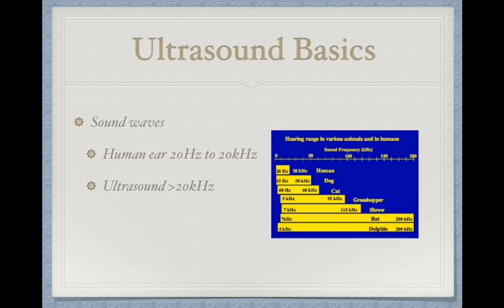And as you can see on the screen here, that's along the lines of what bats and dolphins can hear. So this is really high frequency sound, and not typically what we would hear on that spectrum. This is the diagnostic level of sound waves. Now there are even higher frequency sound waves that are used that are actually more therapeutic, but we won't talk about that today.